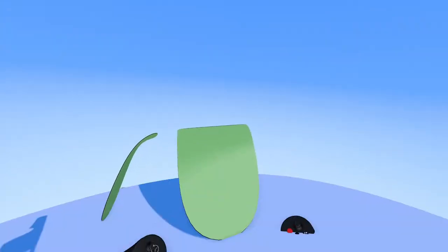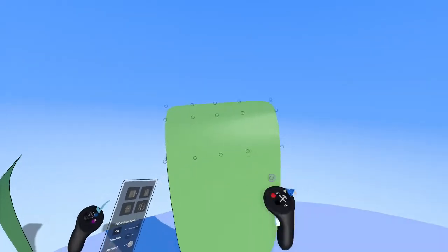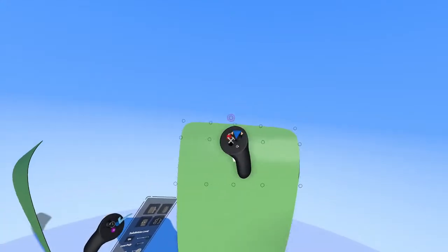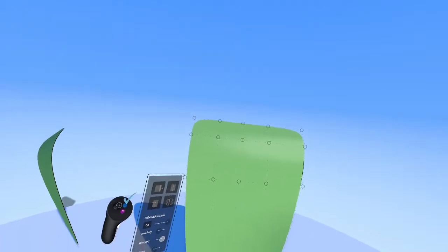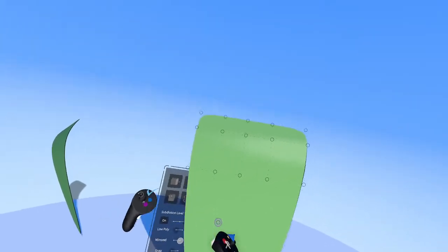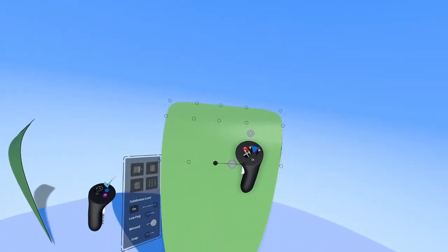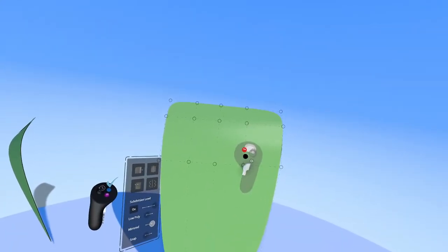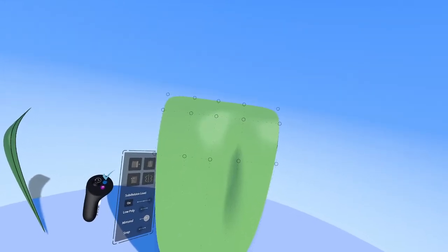So let's make a sub D surface like this and put it into edit mode and drop in a couple of loops here. And so we can see that we have a four-sided surface everywhere on this geometry. Now, the reason I like sub D is it gives you a lot of flexibility when you're building something. Now, we're not modelers right now. We're just designers trying to represent our design in 3D. So what sub D allows you to do is grab an edge, if you don't have a perfect number or you can't use a quad, and delete it like that.